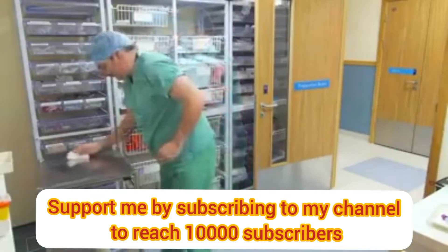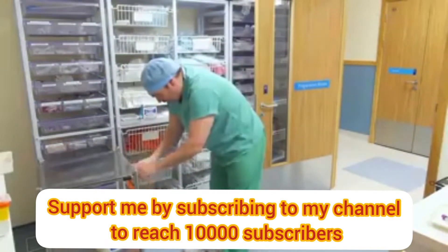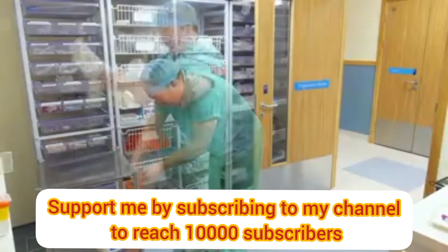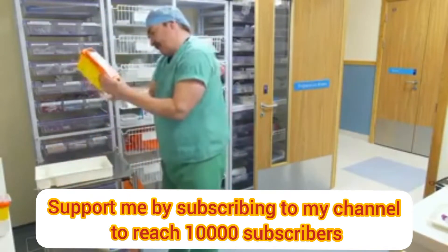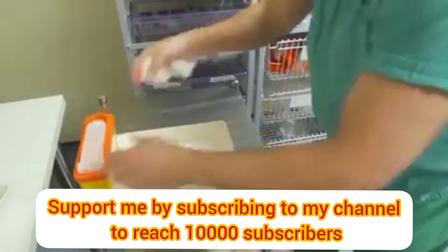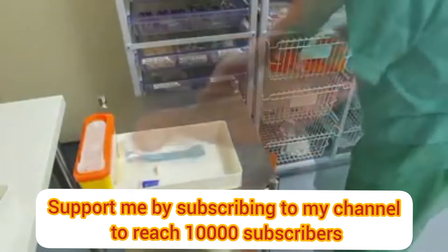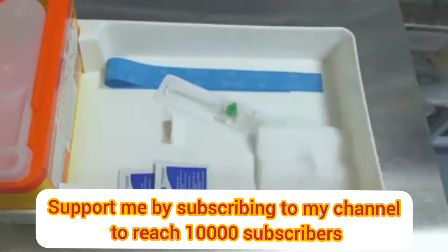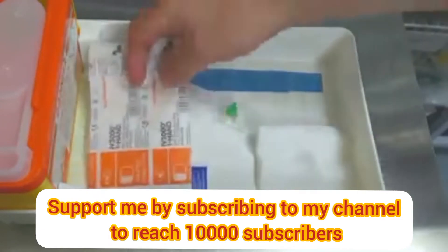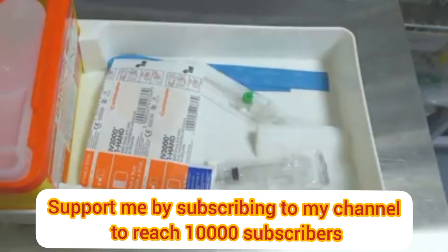Prepare a trolley and ensure all surfaces are clinically clean using a detergent wipe. Attach a disposal bag and make sure you thoroughly clean the collection tray surfaces and underneath the sharps box. Assemble all the necessary equipment for the procedure, checking packaging and expiry dates. Preparation is key and will ensure the procedure goes smoothly and without interruption.